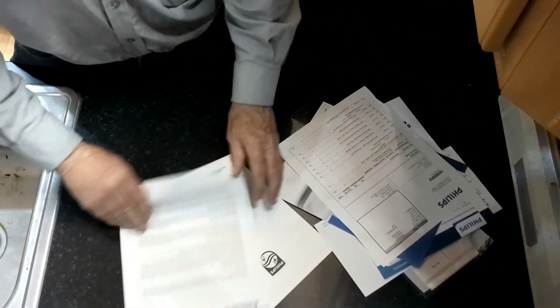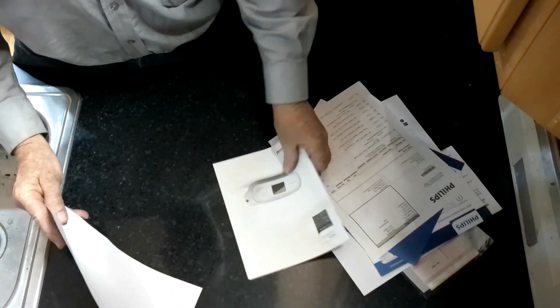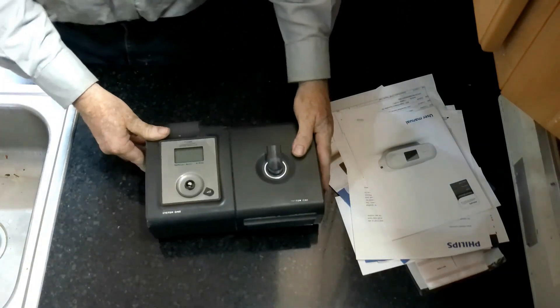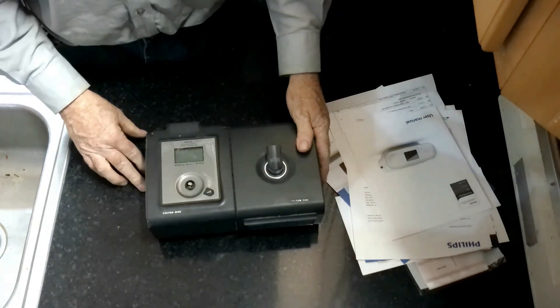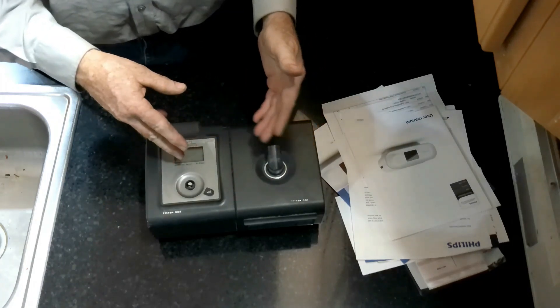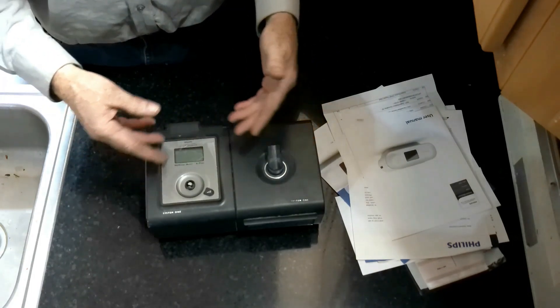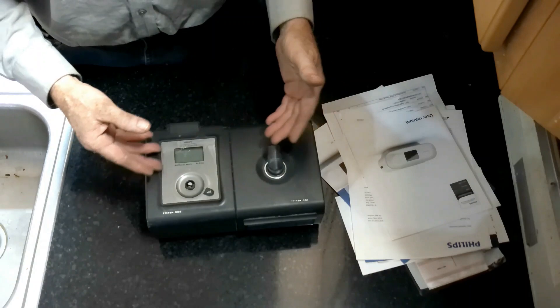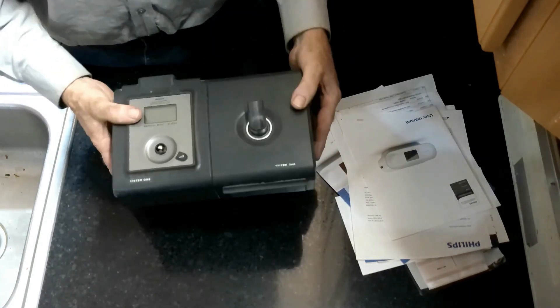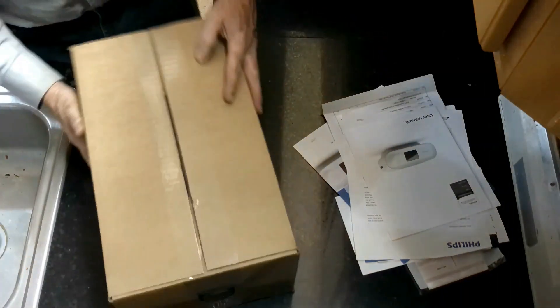We're going to go through here, and there's an owner's manual. This is my CPAP that was recalled — the one with the broken knob. This is the one that had the sound insulation inside of the machine that started to slough off, and I guess went into the airwaves and would go into your lungs and all sorts of things. So this is the recalled one, and this is going to be the brand new one.